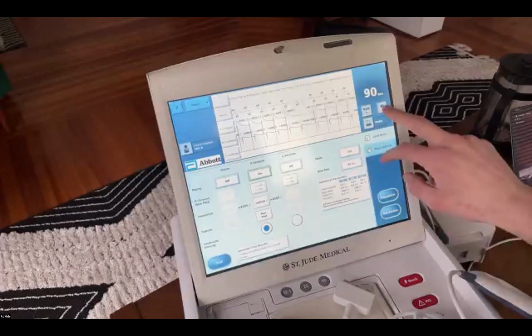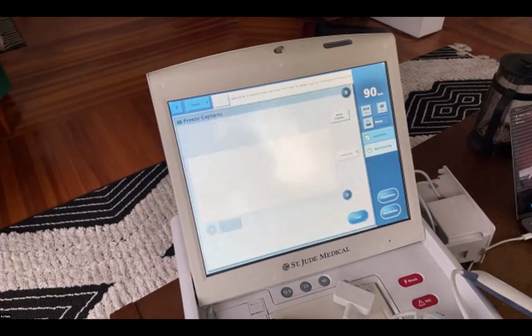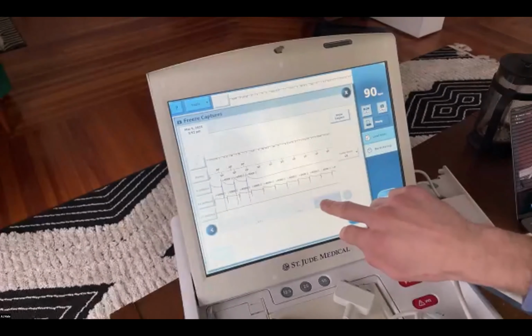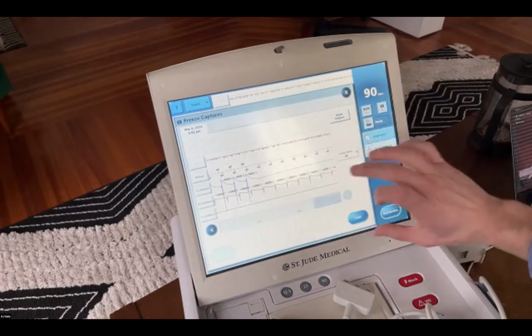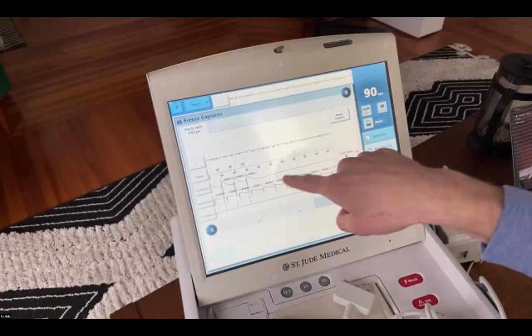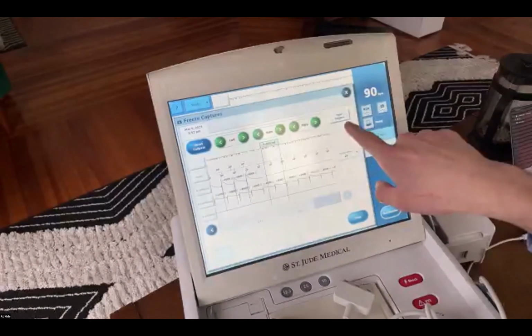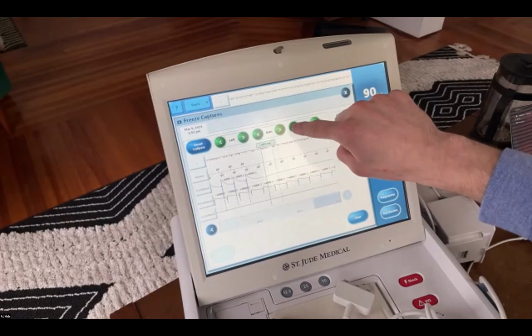In this case, say we had an intrinsic event. I should have showed you this in the programmer. You can always take a picture here. It'll bring up a live, like a screenshot, a freeze capture. If there were atrial or ventricular events here we're trying to pace out of, you can then show your calipers and then measure out the total time.